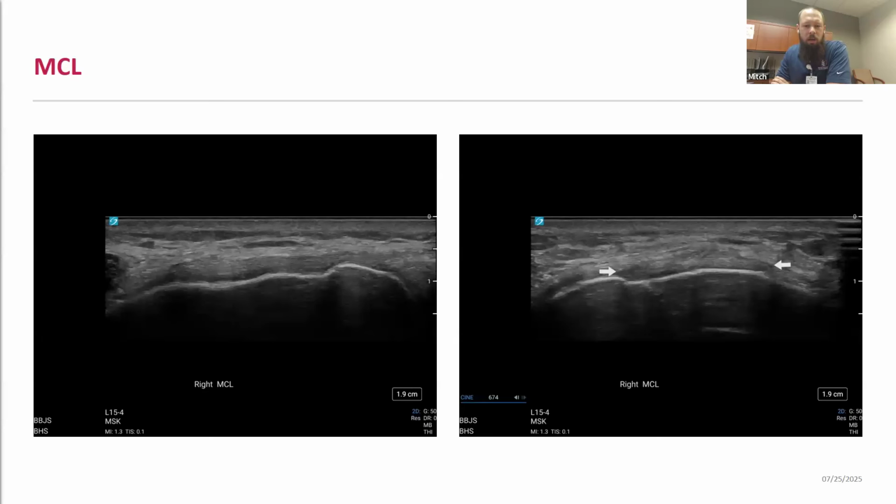And so starting out at the medial aspect of the knee, just talking about general ultrasound setup. For the knee, typically you're going to be using a linear probe. For this case today, I'm using an L15-4 probe. For most knee structures, you'll be able to evaluate these diagnostically with a linear probe. Occasionally, you'll use a curvilinear probe depending on the size and body habitus of your patient with posterior knee structures. But in most of these cases, you'll be able to see everything that you need to see with that linear probe.